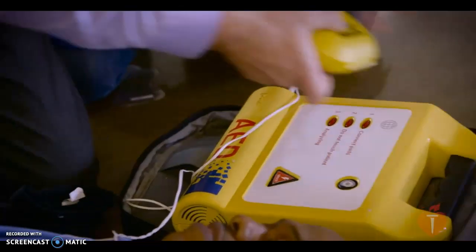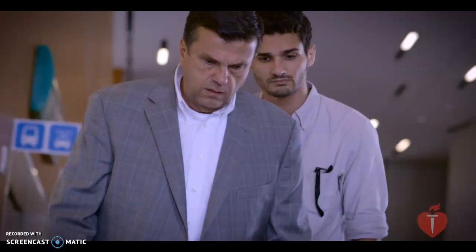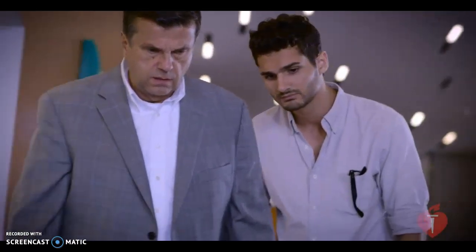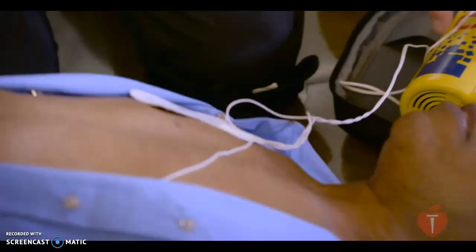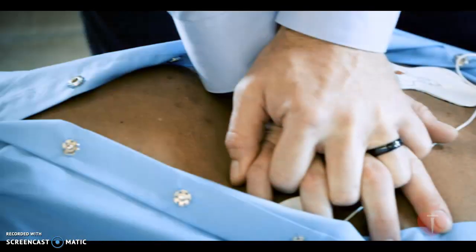Analyzing heart rhythm. Do not touch the patient. Everybody stay clear. Don't touch him. Shock advised. Charging. Stay clear of patient. Everybody stay clear. Deliver shock now. Shock delivered. Begin CPR. Start with compressions.